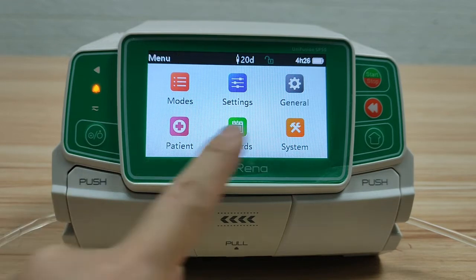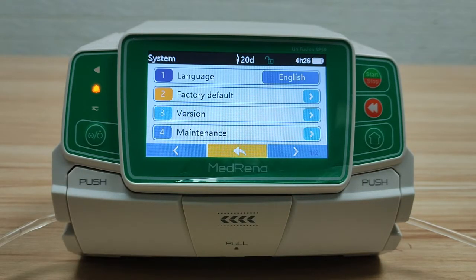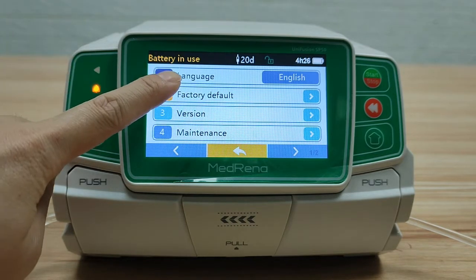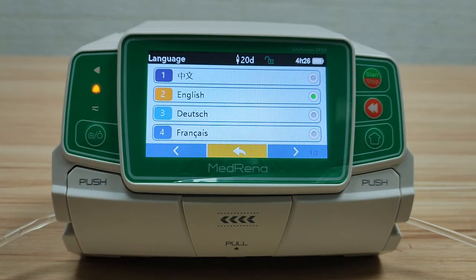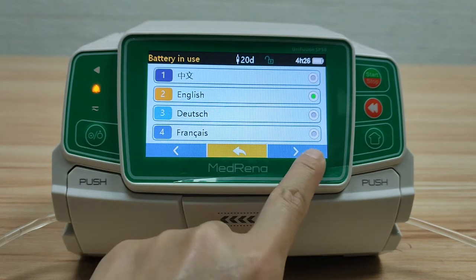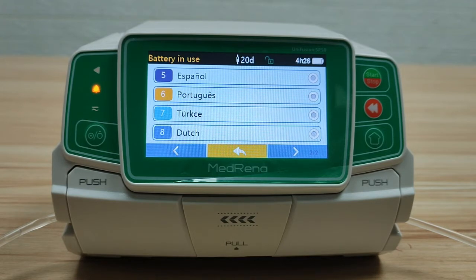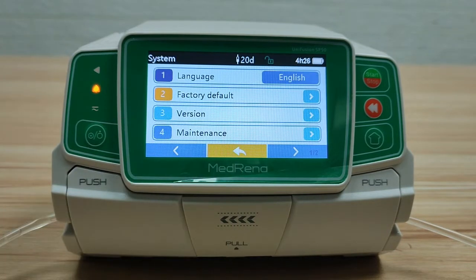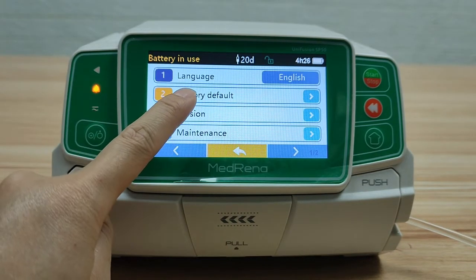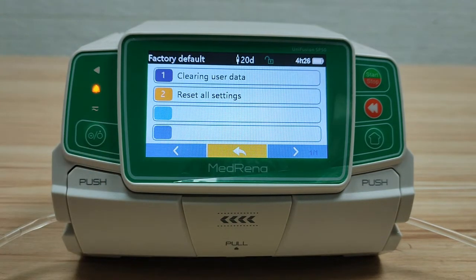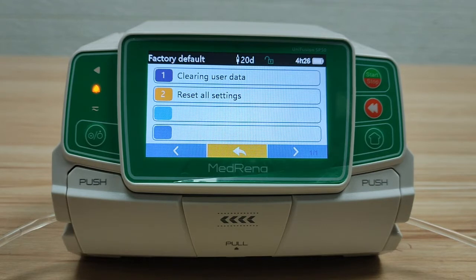The last box is System. First, language: there are eight languages in the display, but more than 12 languages are available — please check with us whether your language is available. Factory default: this item is rarely used by end users; leave it to the service engineer when repair is needed.